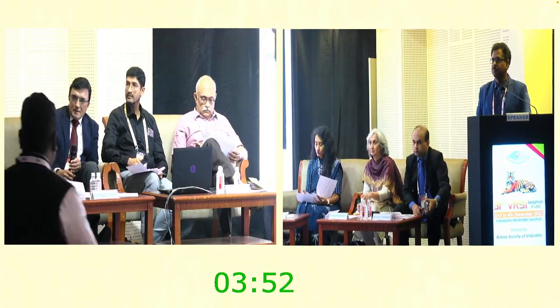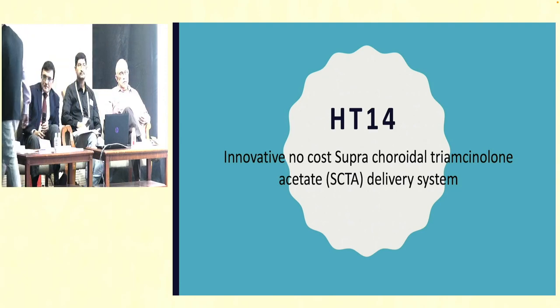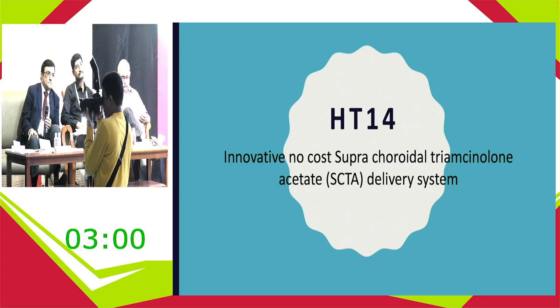Just wanted to know how do you lock the system, because normally when we inject silicone oil we lock it into the bag. Now that you have cut it, do you need to lock this? The whole thing may just burst out once you press the foot pedal. No, you slowly have to increase the pressure, or slowly go for the extracting mode, not a sudden thing. Another advantage is you can reduce the aspiration and the injecting force so drastically. You can use this needle with the conventional VFC, but with this micro VFC you can reduce it to almost 1/10.